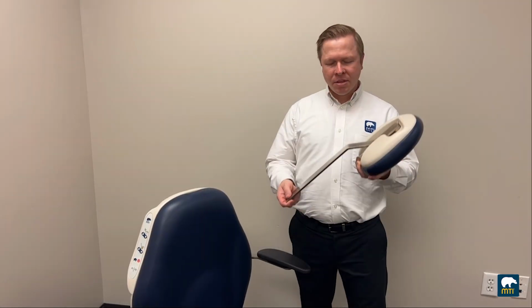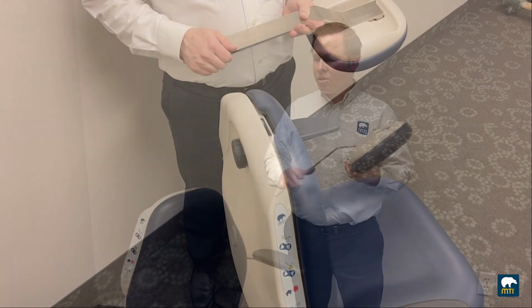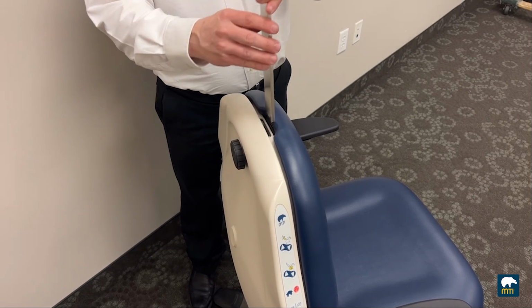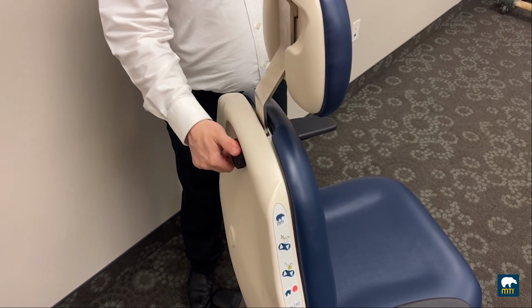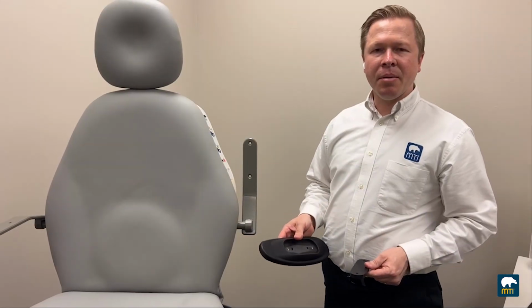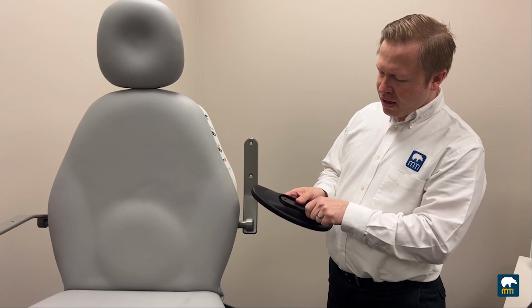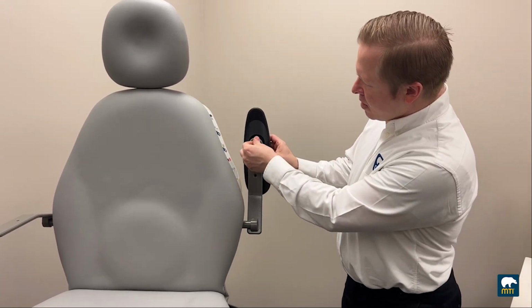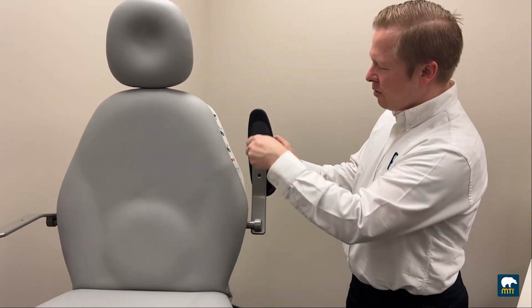The 403 comes standard with a non-articulating oval headrest, which is packaged separately. To install the headrest, loosen the knob in the back of the chair and insert the headrest into the receptacle and tighten back up. The next step is to install the armrest cushions. To do so, put the insert into the armrest and match up the holes on the armrest and fasten the screws using a Phillips head screwdriver.